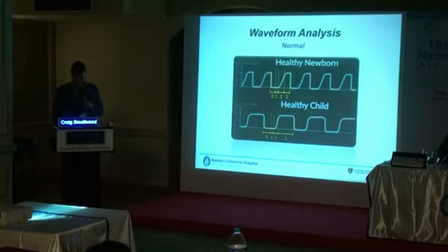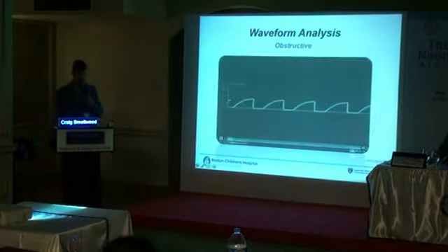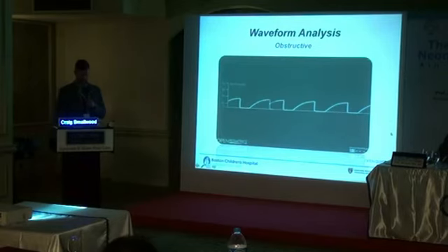Okay. So we're going to look at obstructive capnography.